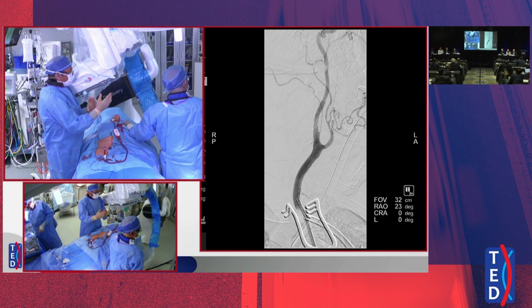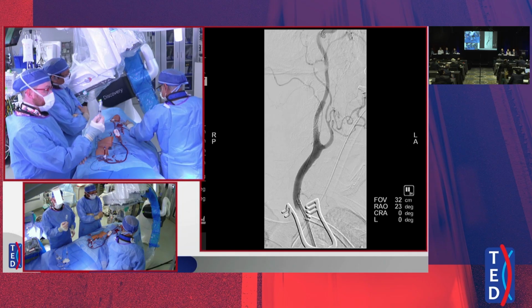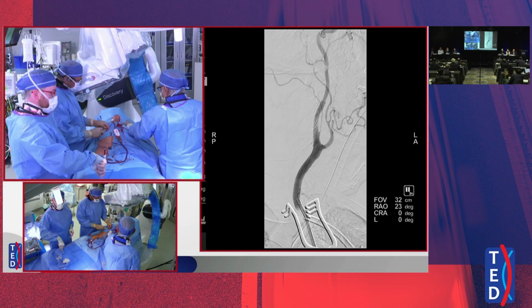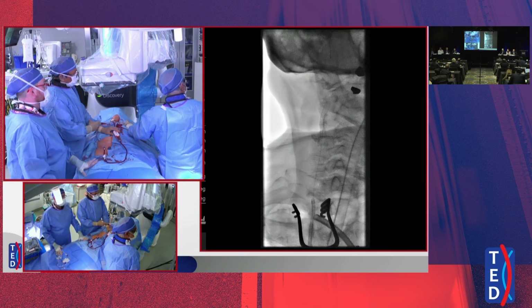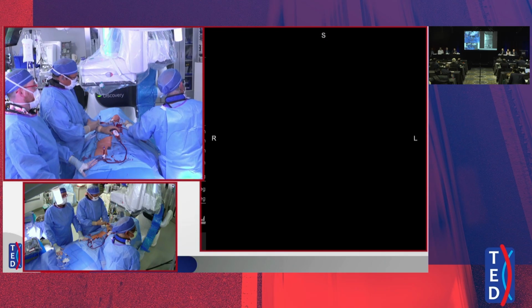Get me another view. Let's take another view and then see. I know that's another thing: if you're not too concerned, you just take a couple of views and then go from there. Yeah, go AP. Take your marks off, please. I think that's not bad, Anthony. Come a little low. Drop your eye down a little bit.